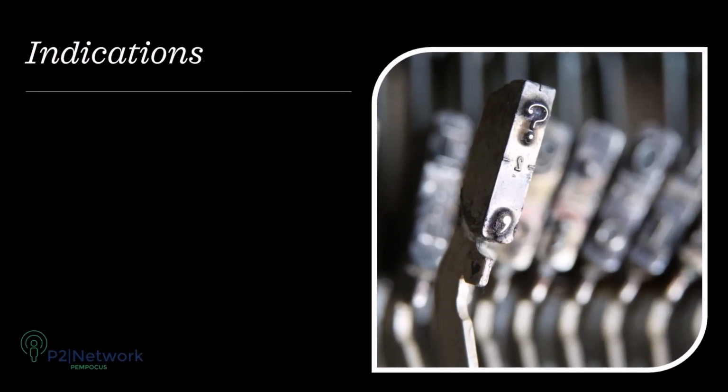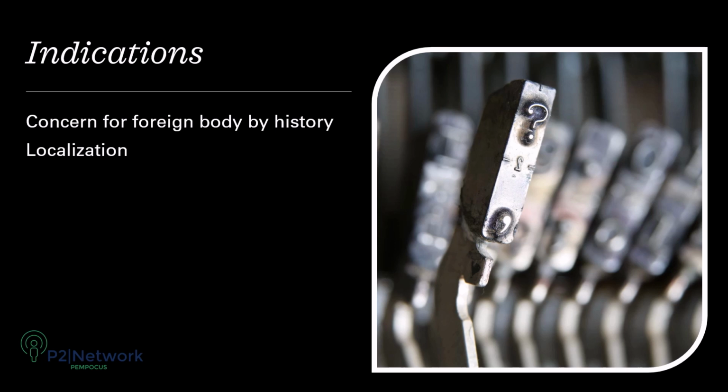So the indications to perform an ultrasound are that the patient has a history of foreign body, if you want extra help to localize, especially if this is a radiolucent object, or if the patient has swelling, redness, pain, mass, fever.